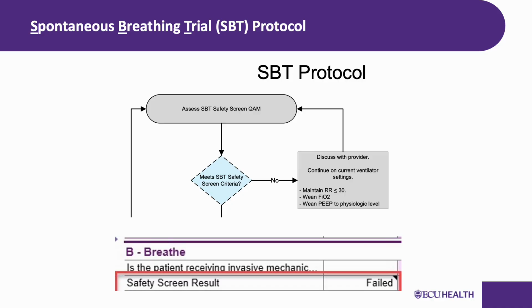Take a good look at the layout of this documentation view. Notice that the spontaneous breathing trial row appears within the invasive ventilation group, and this is where that daily screening lives, whether the result was indicated, in progress, failed, or passed. The reason we are standardizing the documentation is exactly what we talked about in the SBAR section. We need our care to be visible, consistent, and defensible. This documentation workflow accomplishes all three.